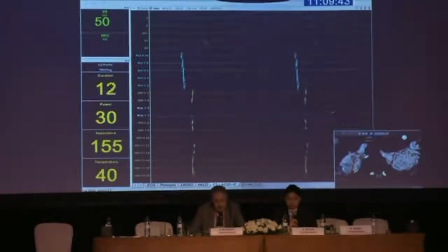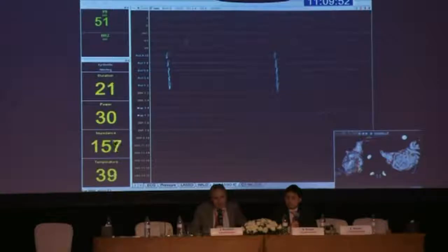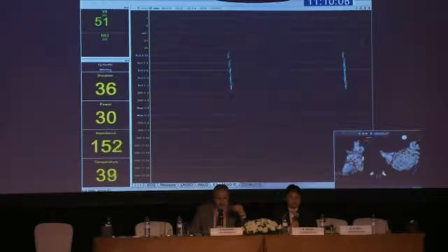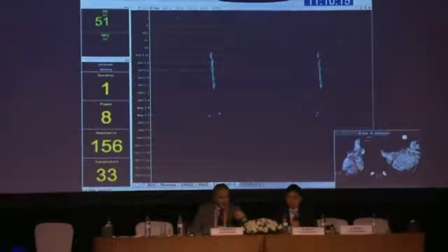Interesting observation came out from our experience when we did studies with Endosense technology and remapped the patients after 3 months. It came out that even if you measure contact force and you carefully apply criteria that you have a reliable FTI, you still have some gaps that can occur, especially if you jump with the catheter back and forth. So if you leave some areas like gaps and then you come back to this area later on.